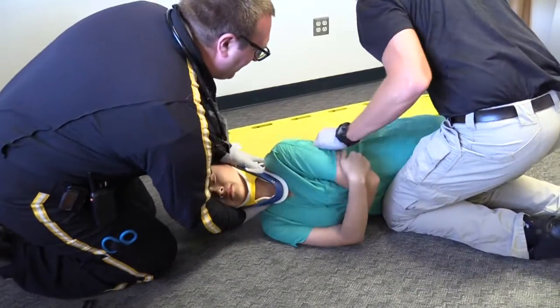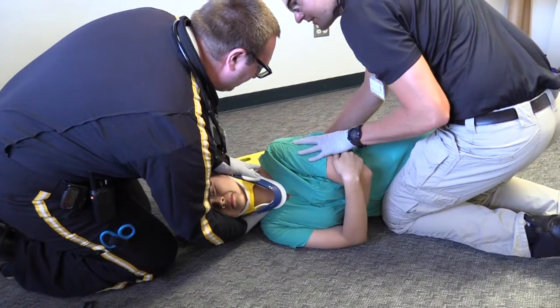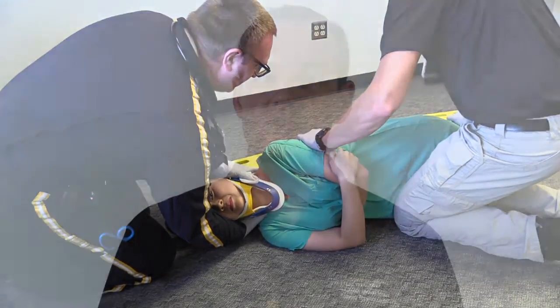When ready, the person holding cervical immobilization will be in charge of when the patient is rolled. While the patient is on their side, I will palpate down the patient's spine, feeling for step-off and listening for the patient to report tenderness or pain.